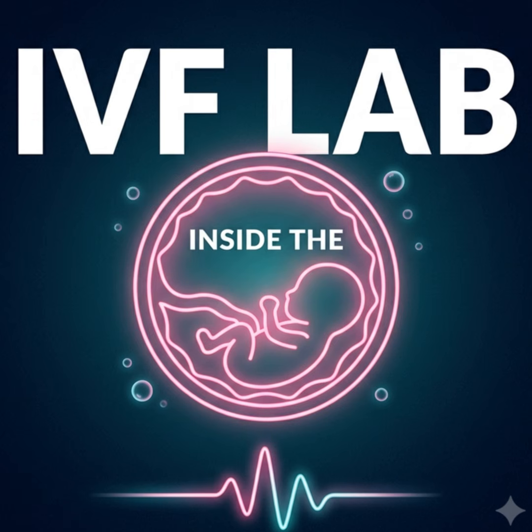You can. Seeing that polar body emerge on the time-lapse footage is the visual confirmation that the oocyte is biologically ready to accept a sperm and be fertilized. Once fertilization occurs, the morphokinetic stopwatch truly starts. The very first milestone we track is the time to first cleavage. The exact moment one cell becomes two. Exactly. And the rhythm of that division matters tremendously. If an embryo divides too early or struggles and divides much too late, it historically correlates with lower developmental potential.